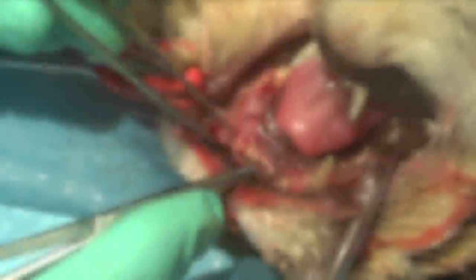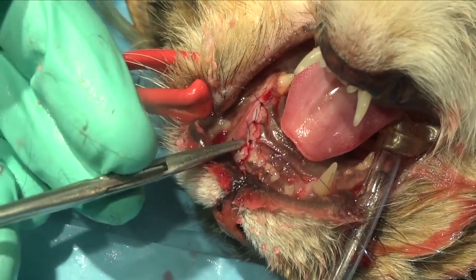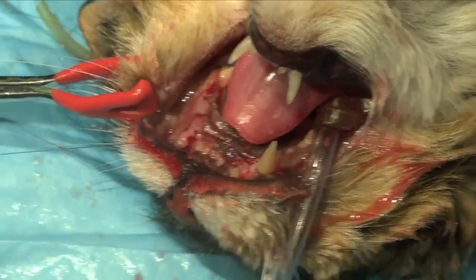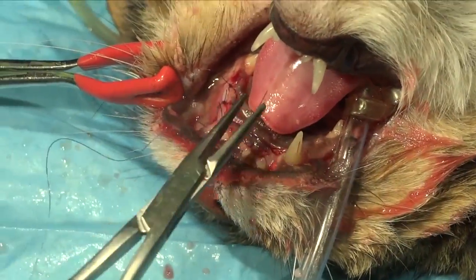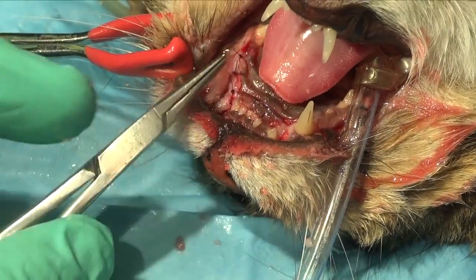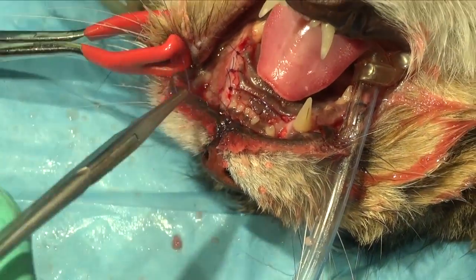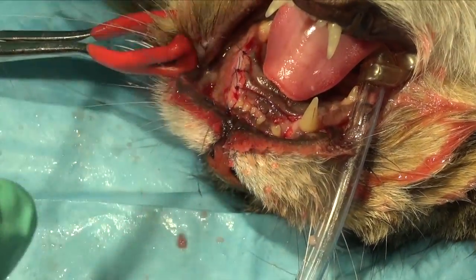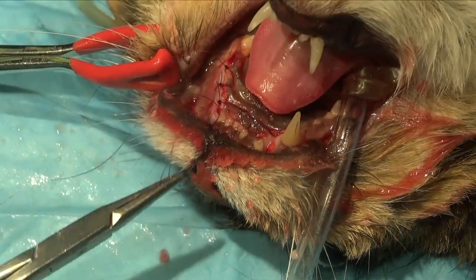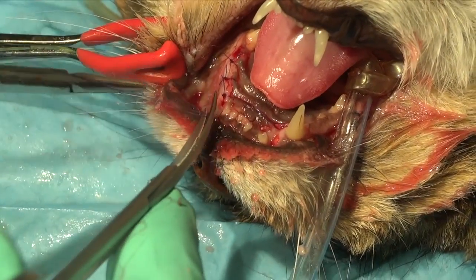There are cases when radiographically it appears that the entire apical one-third to two-thirds of that root is involved with type 2 resorption. However, there are cases where we can actually go up and start to paint away that bone, and we find that indeed we can extract the whole tooth and the root in its entirety. So that's certainly an option in some of these cases, but not something that we see commonly.